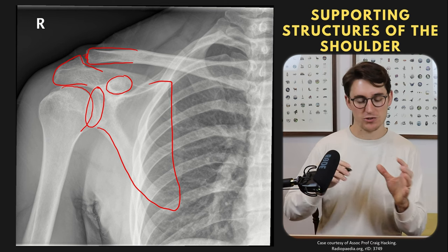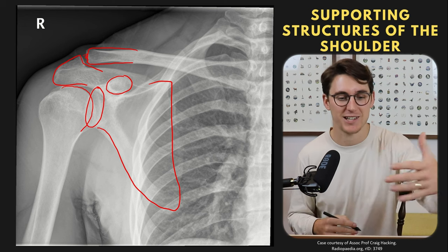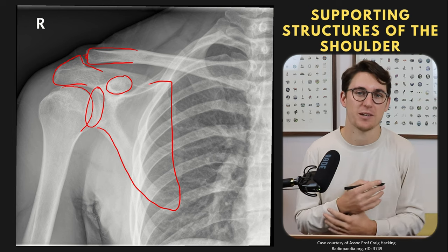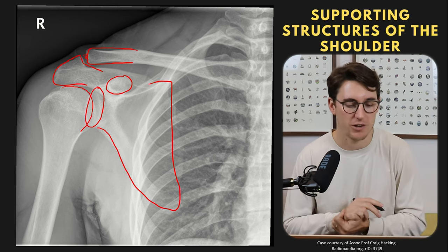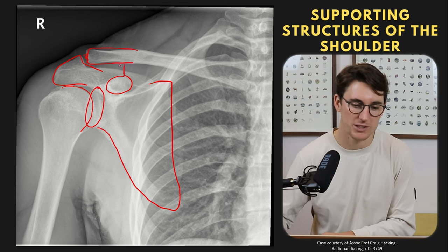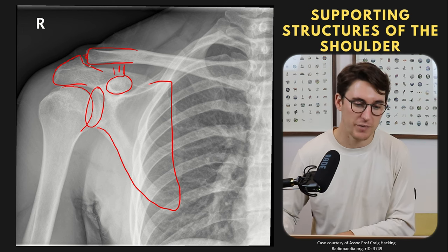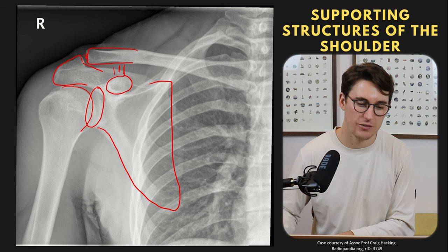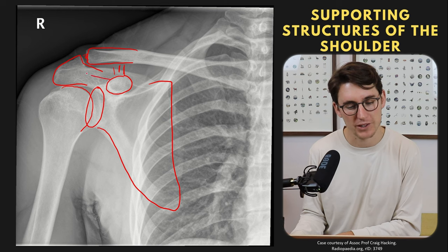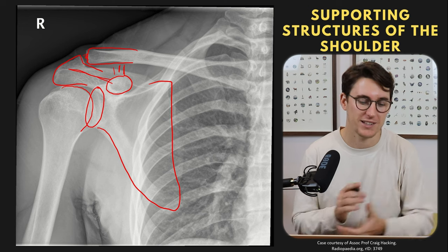The most important thing to remember is that the coracoid process comes out anteriorly and the acromion is posteriorly — on MRI we use those landmarks to figure out orientation. Looking at the ligaments: we have our coracoclavicular ligaments attaching the coracoid to the distal clavicle, our acromioclavicular joint, and a really important coracoacromial ligament that makes the roof of our coracoacromial arch, which we'll cover later in MRIs.